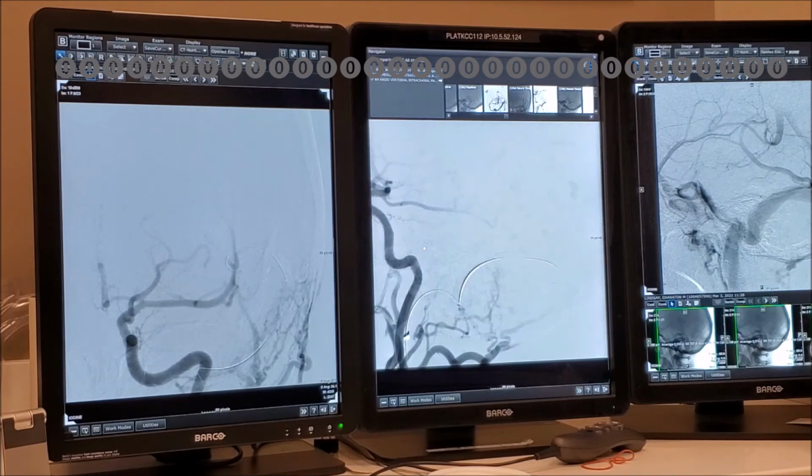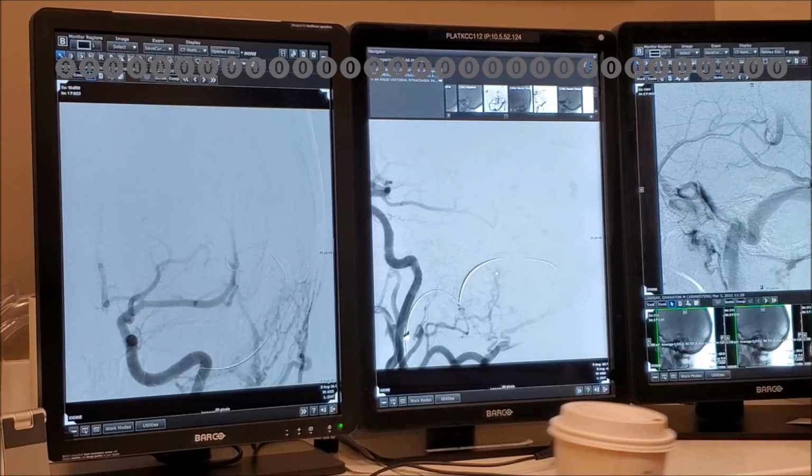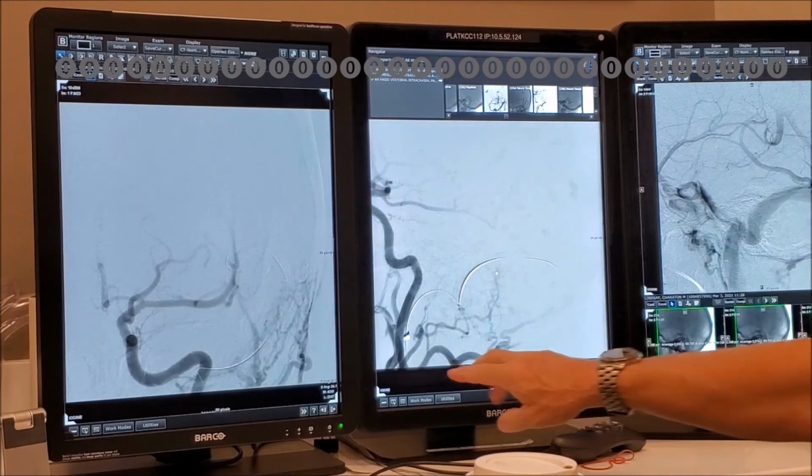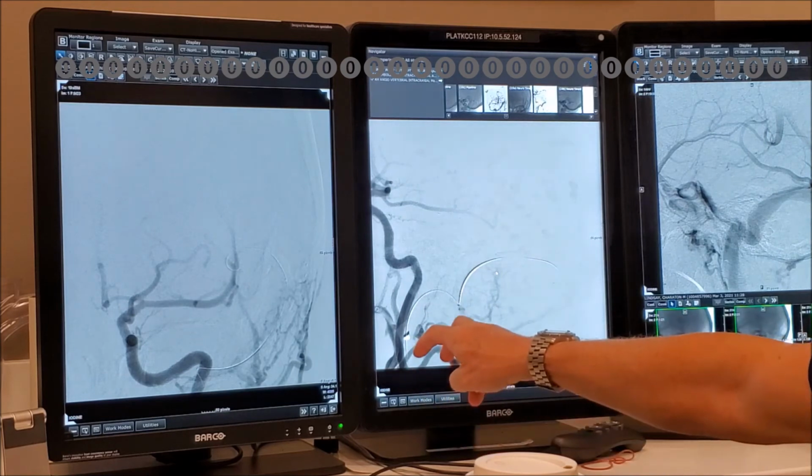Let's say you couldn't close it, you try and it's too small. What else could you do? Striker. Use a stent, right? You can use multiple balloons. You only have this balloon, you try it, it's not big enough, you put another one. Yeah, multiple balloons. Exactly. But you have to be thinking that way so that you know that the guiding catheter you're going to put can take two.